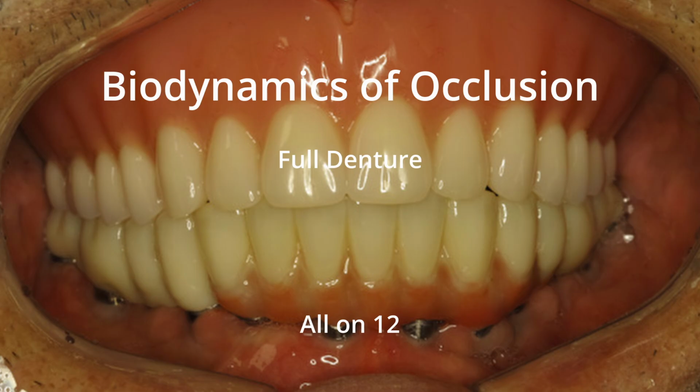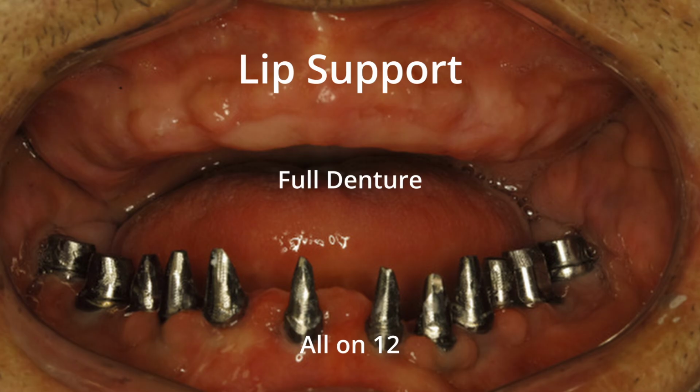After 5 to 10 years, the maxillary removable denture can simply be remade. Then after another 5 to 10 years, it can be remade again. To prevent excessive wear of resin teeth, metal capping can also be applied to the occlusal surfaces. With this approach, patients can live their entire lives without significant aesthetic or functional dental problems.